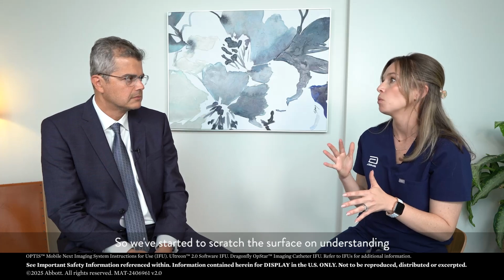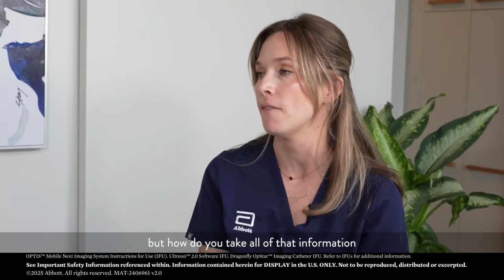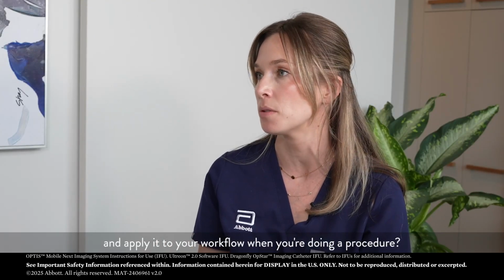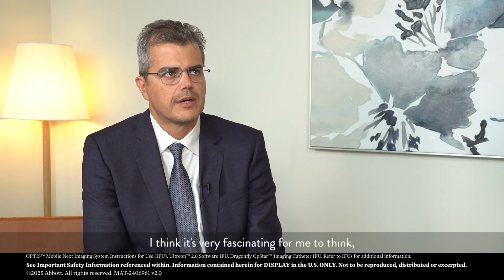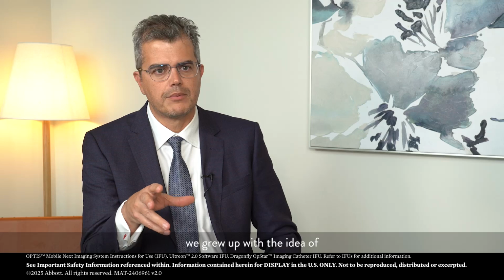So we've started to scratch the surface on understanding what we're looking at from a morphology perspective, but how do you take all of that information and apply it to your workflow when you're doing a procedure? I think it's very fascinating for me to think, at least my generation of interventional cardiology, we grew up with the idea of intravascular imaging, namely IVUS, post-stent.